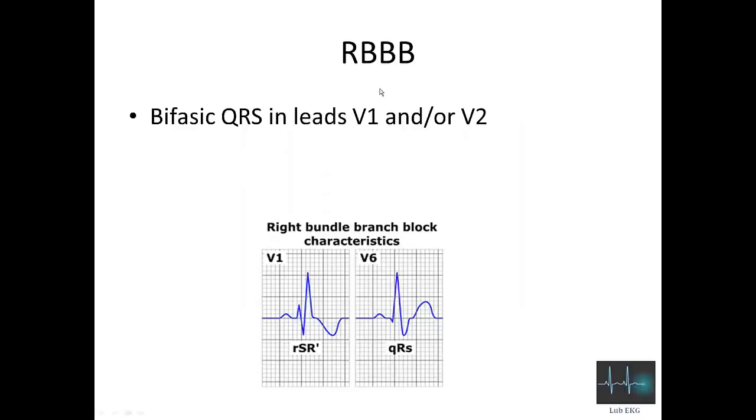Right bundle branch block and left bundle branch block. You have actually several diagnostic criteria for this. We will just focus on one. Unless we're going to be cardiologists, we basically have to keep it simple so that we can send these guys that we think have a bundle branch block to a cardiologist, or treat them for one of the things that a bundle branch block might mean. We will talk more about that in another lecture.